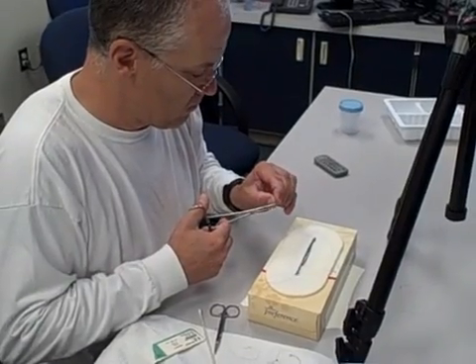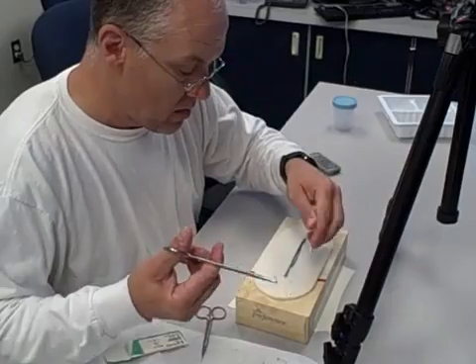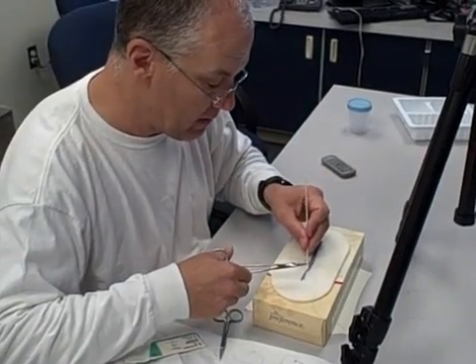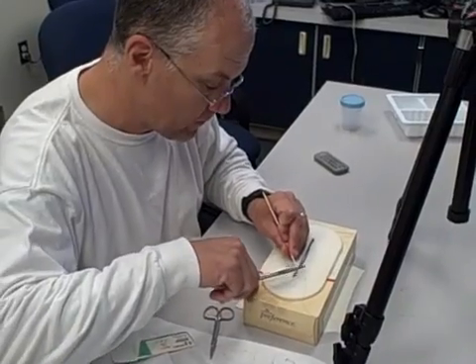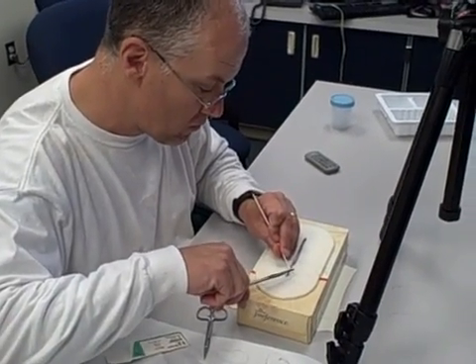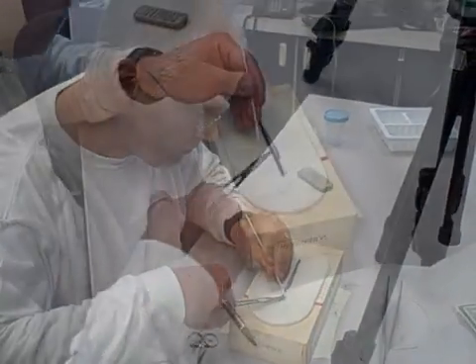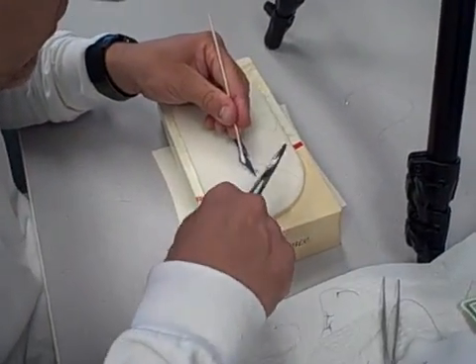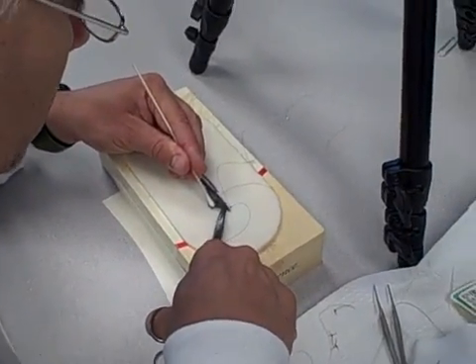If there's puckering, you're too tight. And that can leave you open to gaps where you can have dehiscence of the wound. Also, just when it heals, it'll heal with a little pucker to it and make the scar worse. This definitely is one of those finesse things. You have to take your time.